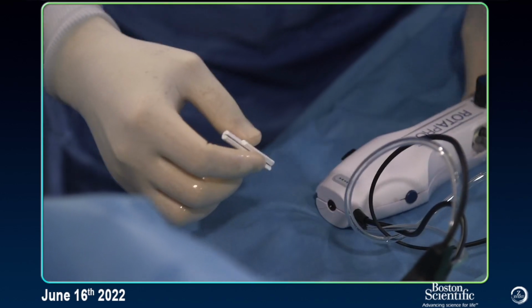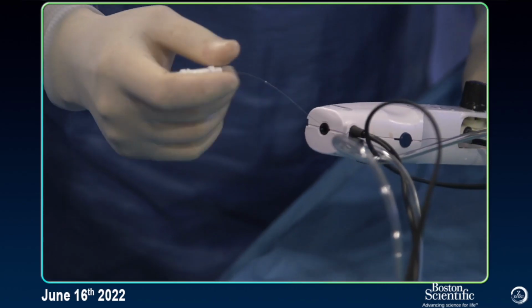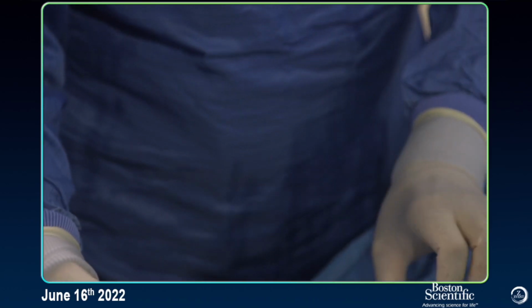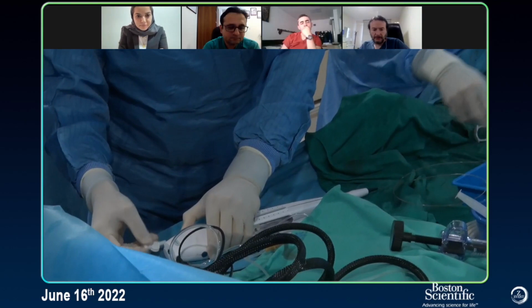A knot or swelling of the wire is a nasty thing. Yeah, so everyone wants to avoid that. You can leave this wire clip over the table, or you can set it at the docking port, which we will do.